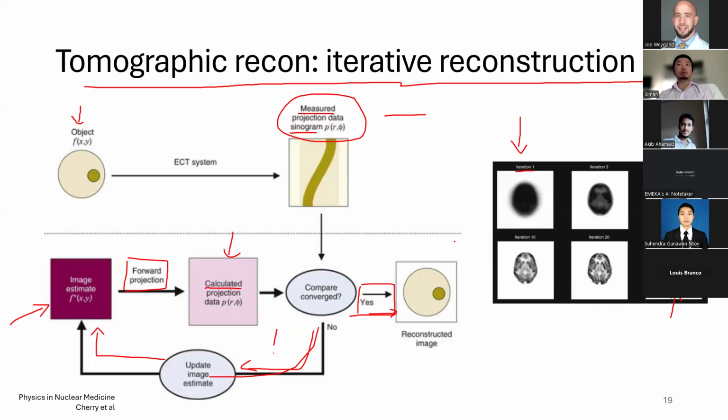And if you want to do dosimetry, then you have to use an objective function that's different from the diagnostic objective function. In diagnostic, you usually use contrast to noise ratio, or activity recovery percent. Those are fine for diagnostic, but for dosimetry, you need to use the absorbed dose, whether it's mean or DVH based. The objective function of the iterative reconstruction needs to match the need, or how you are going to use the images, in other words, the imaging task.